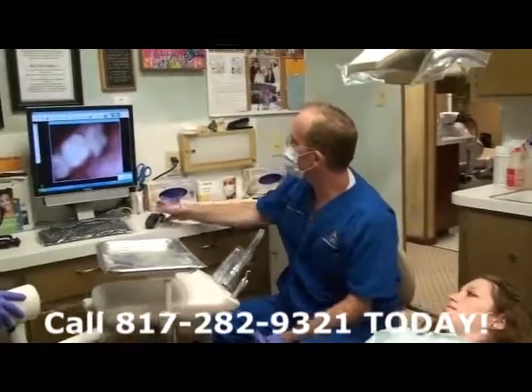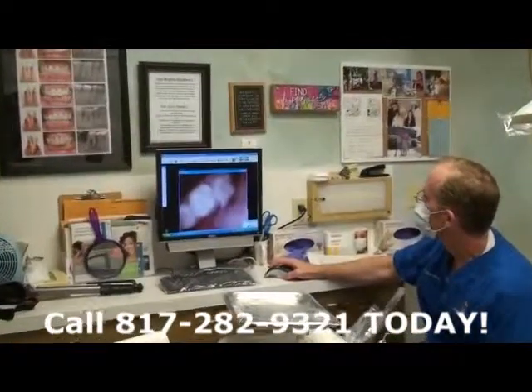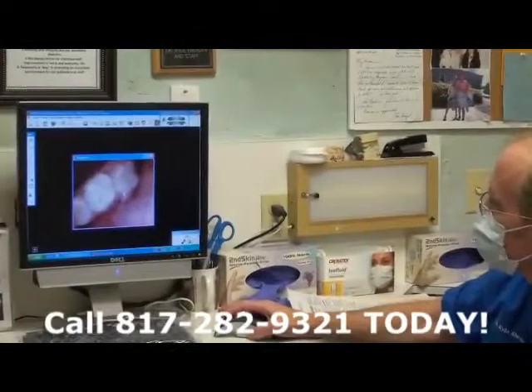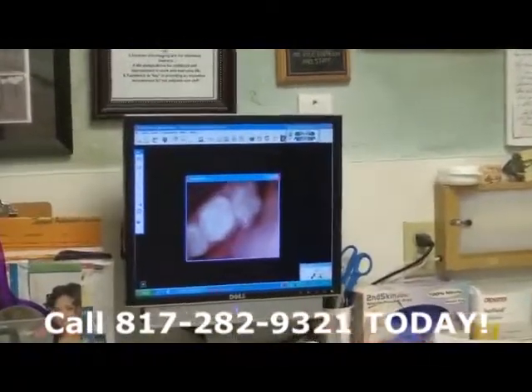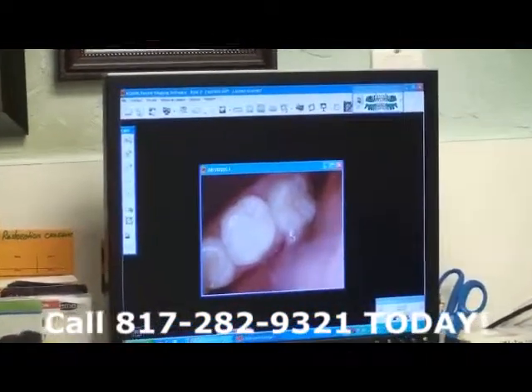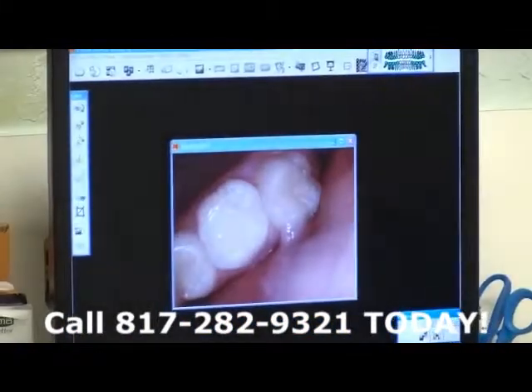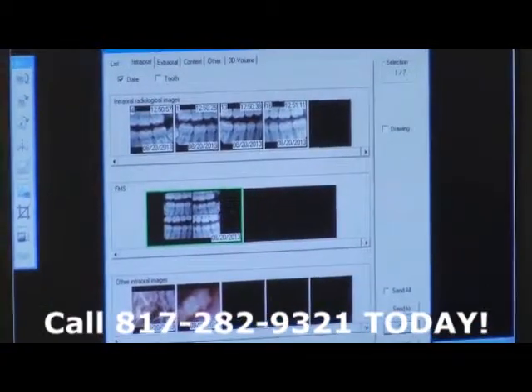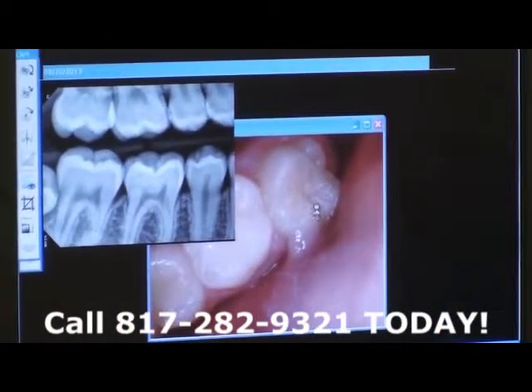Okay, that's all right. So this is an example of our intraoral camera. And you can see on this image right here, it looks all healthy. This is what all your teeth look like. They all look pretty healthy. Let's look at your images again. So now we can bring up your images.